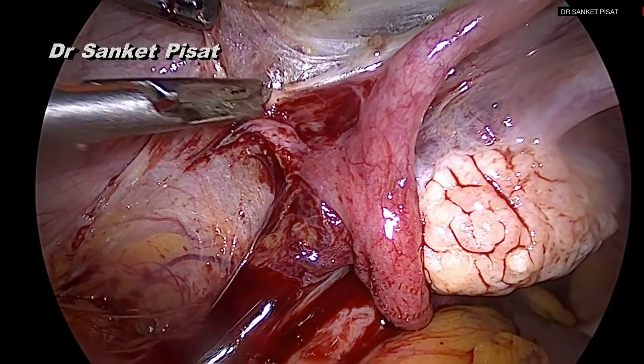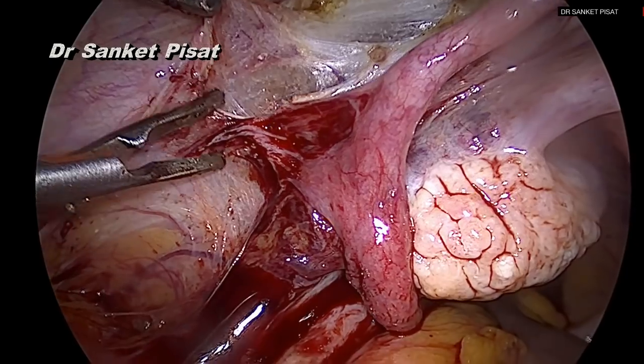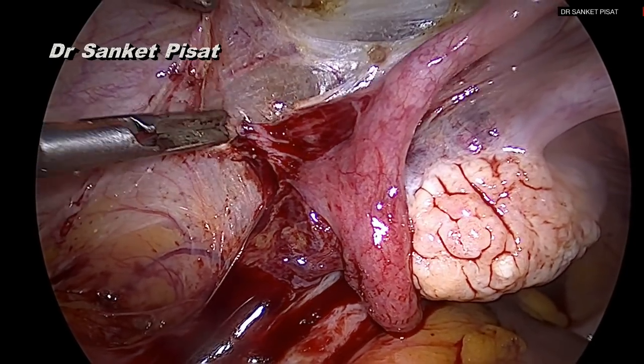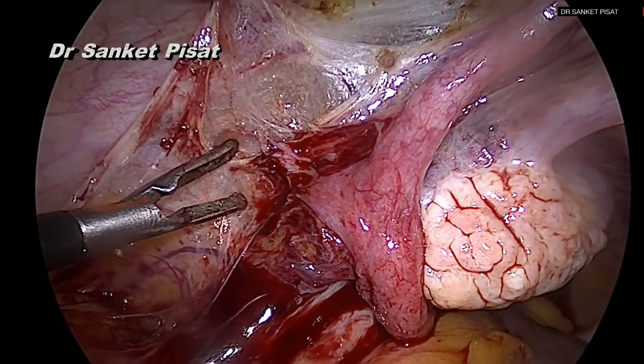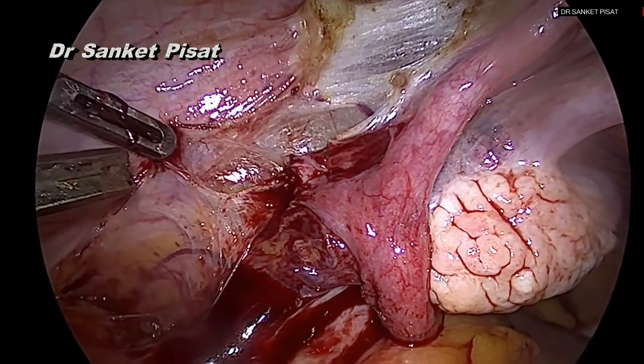Once the surgeon becomes more and more comfortable with the pelvic wall structures, he or she can choose to open the retroperitoneum in multiple different ways and perform uterine artery ligation in several other ways, which actually may be quicker.